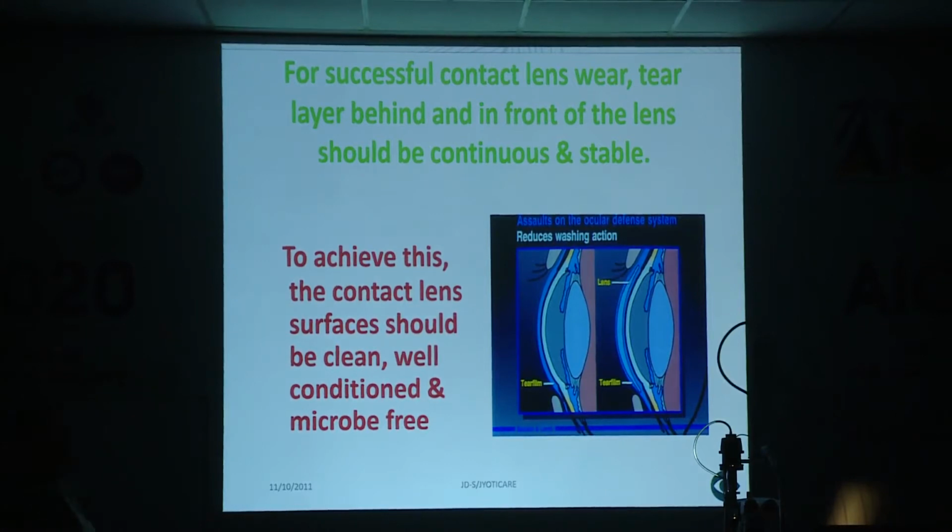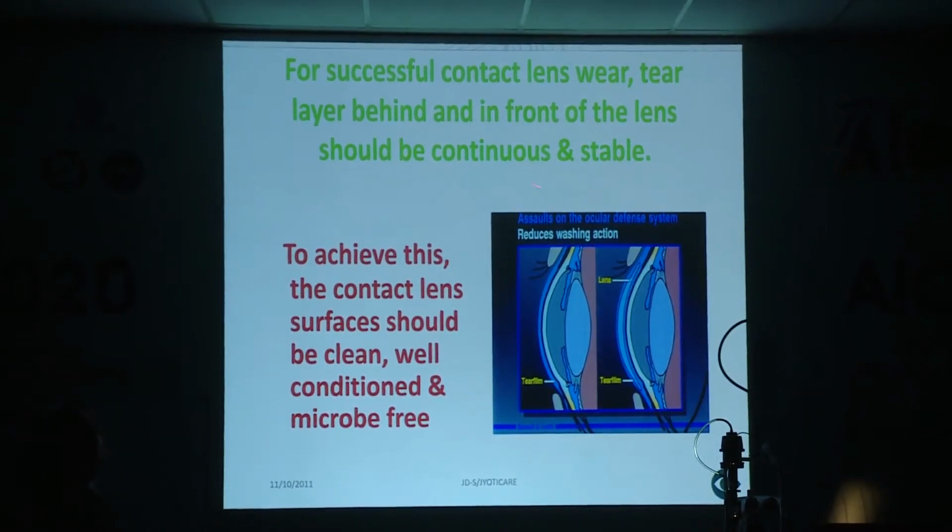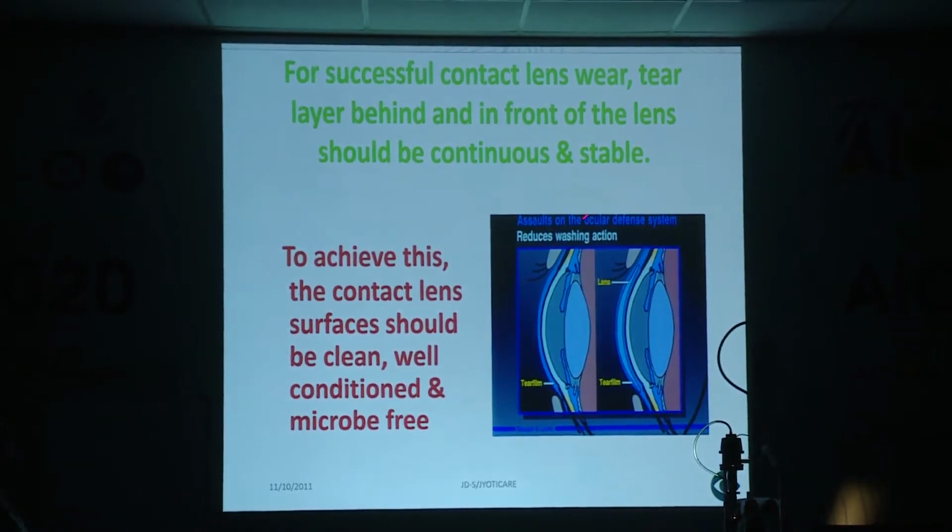Okay, so to have a continuous tear in front of the lens and behind the lens, to make sure that the lens has comfort, you need to achieve a clean and disinfected and microbe-free lens surface.